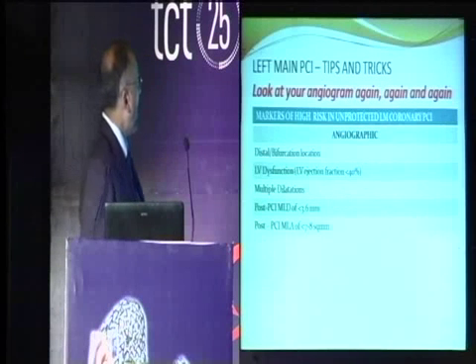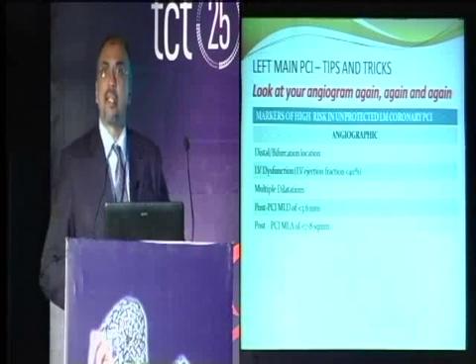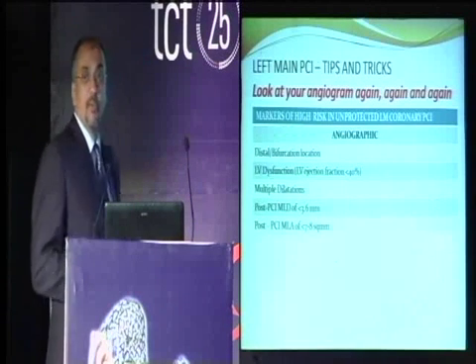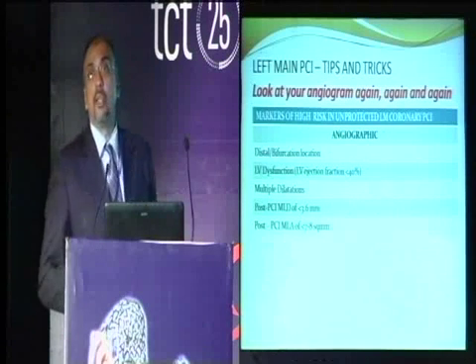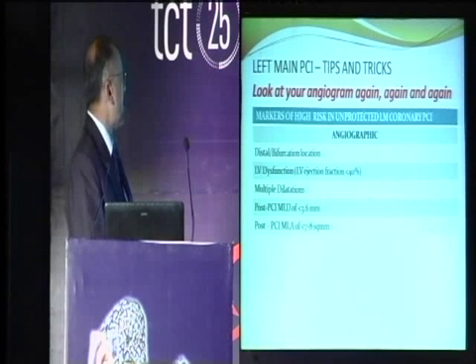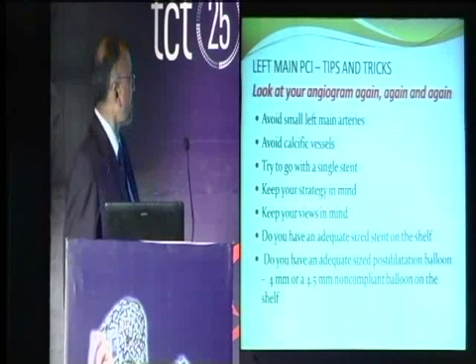So now, having looked at your angiogram, look at it again, because you do not want to do a left main angioplasty on a small vessel. If at the end of the angioplasty you feel you are not able to get a minimal luminal diameter around 3.5 to 4, better not to do that, because the results are not very good. And then I'll come to the IVUS findings later. Of course, a bifurcation, LV dysfunction, and requirement of multiple dilation increases the risk of these procedures.